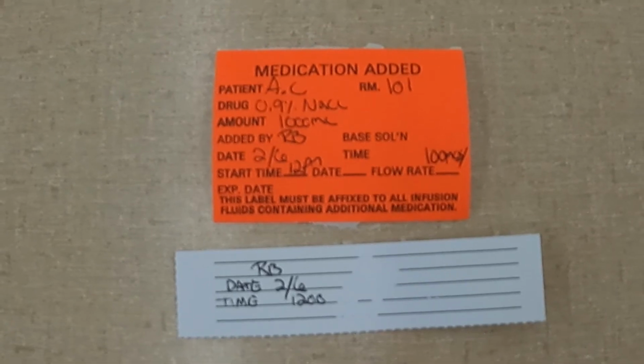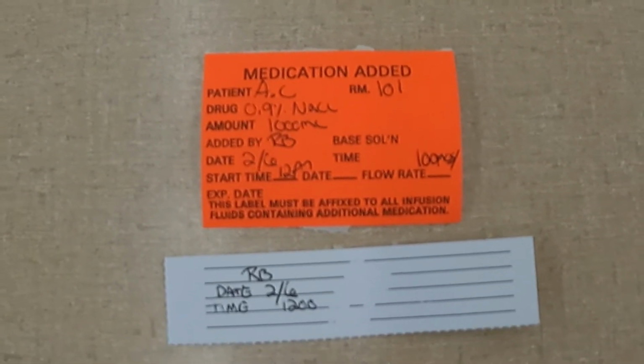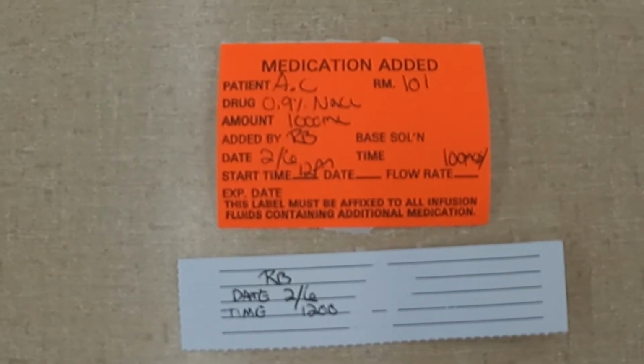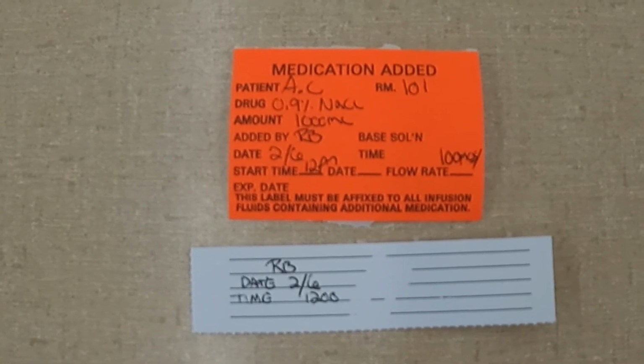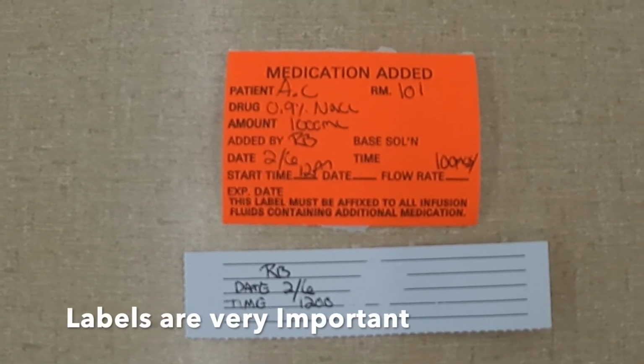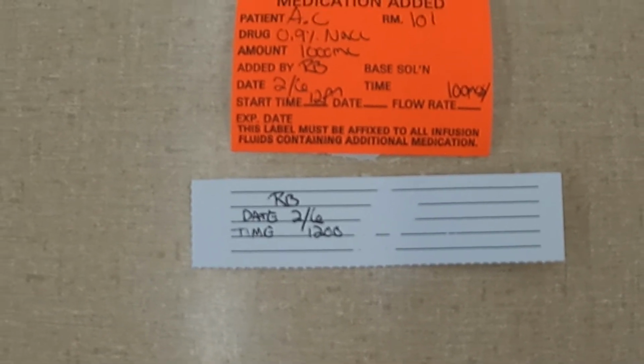So I've prepared the labels both for the IV medication and the IV tubing. The top one, the orange one, is the one that we're going to place on the IV primary bag. And again, it has the patient's initials, the drug, the amount, my initials, the date, and the time. And then the one below is the one that we're going to attach to the IV tubing. And again, it has my initials, the date hung, and then of course the time.